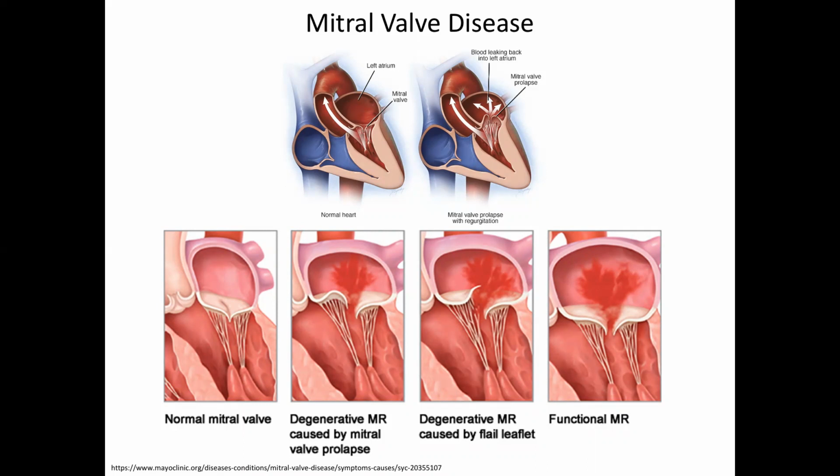You can do it through a port on the patient's chest and push it in through the apex of the left ventricle and up into position. Another opportunity would be to come through the right side, go into the right atrium, go across into the left atrium, and make a very sharp turn and put it down into the mitral valve, right?